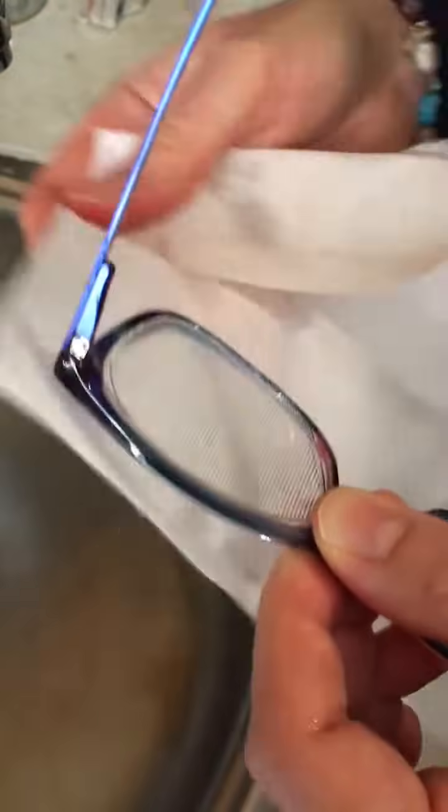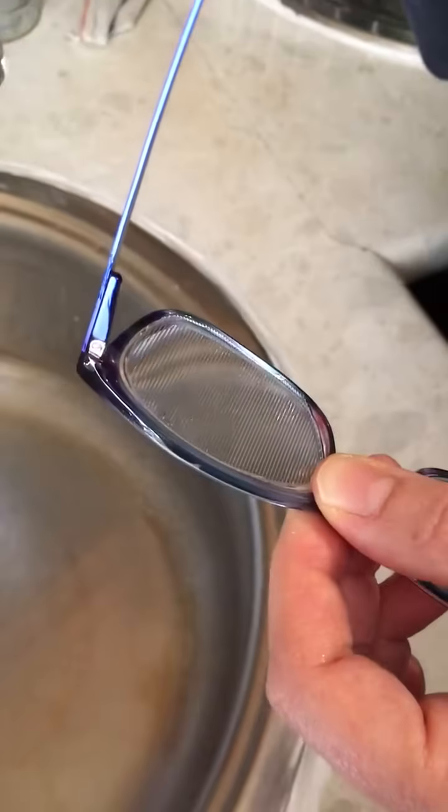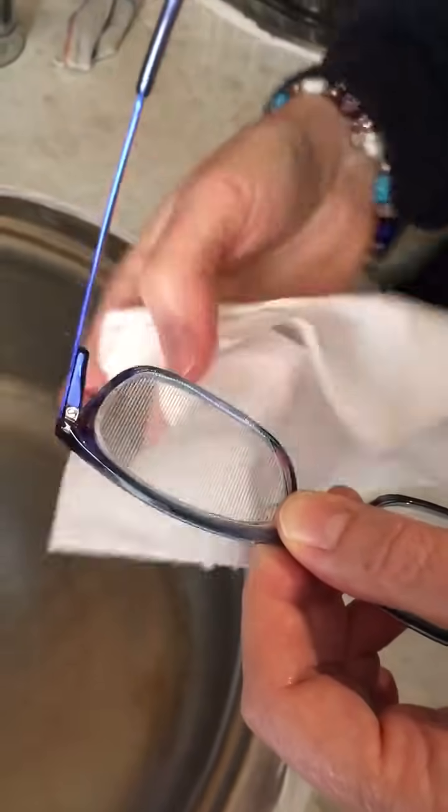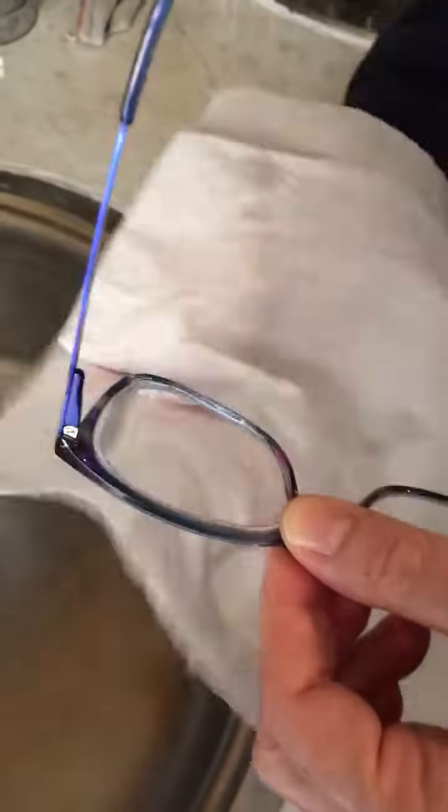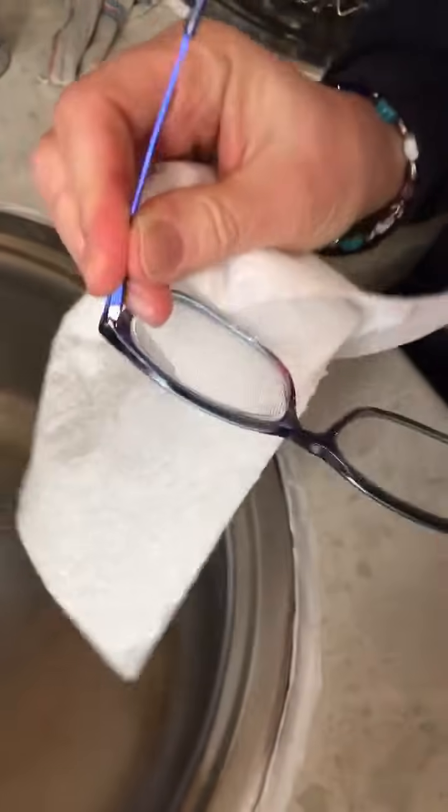Or if you've got too much air underneath it, you may as well just take it off, put water underneath again, and just start again. Don't worry — you'll get it. And then you're ready to go.